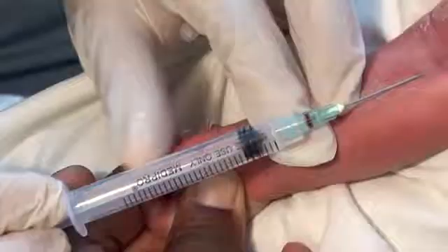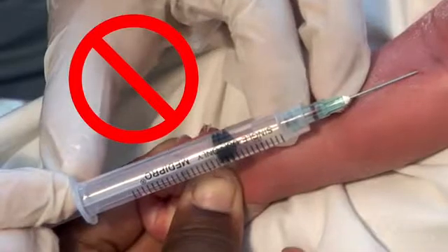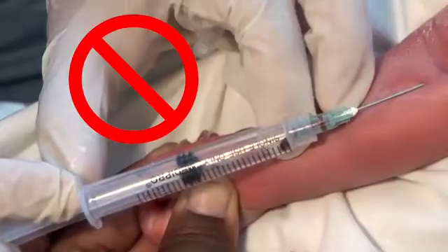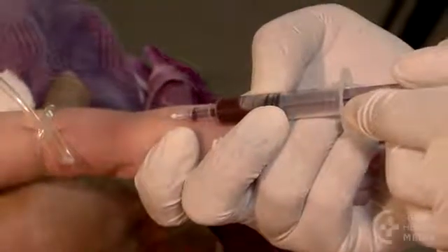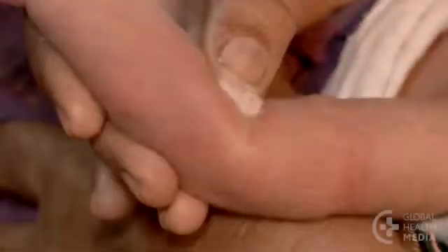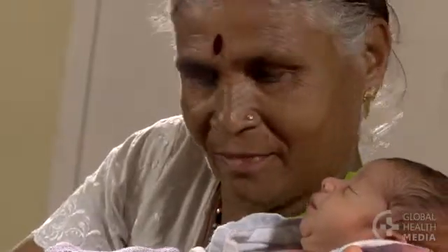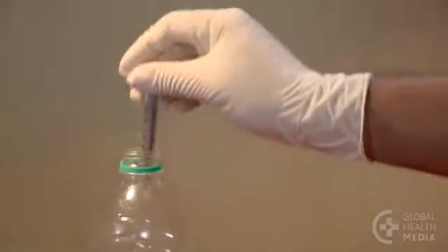Be patient. Pulling back too forcefully will collapse the baby's tiny veins and you will not get blood. Draw up the amount of blood you need. Release the tourniquet. Remove the needle and cover the site with a cotton ball. Fill the labeled tube and safely dispose of the needle.